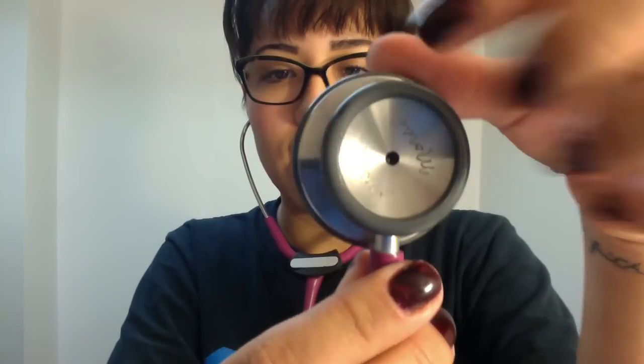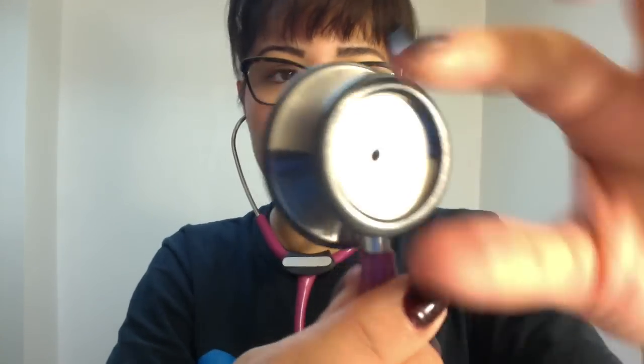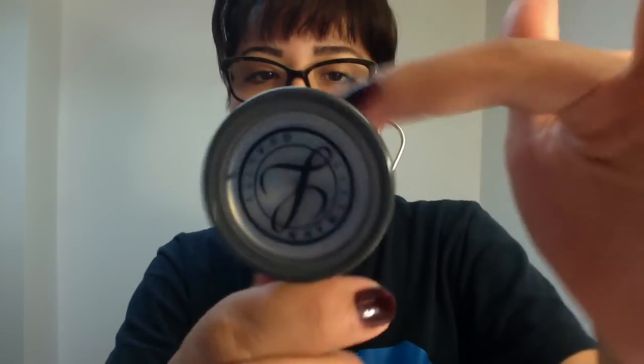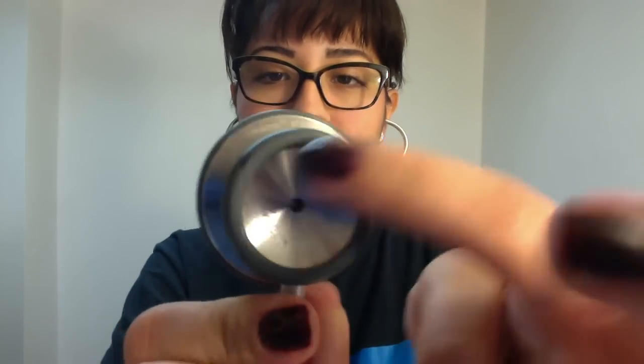For those who have an adult side and a pediatric side, which is much smaller, those might be slightly different. But you don't always have to look at the hole to make sure your bell is closed. You can do it by sound: if you have it in your ears and you tap it and it's really loud, then your bell is closed. If you twist it and tap it and you can't hear the tapping, then your bell is opened.